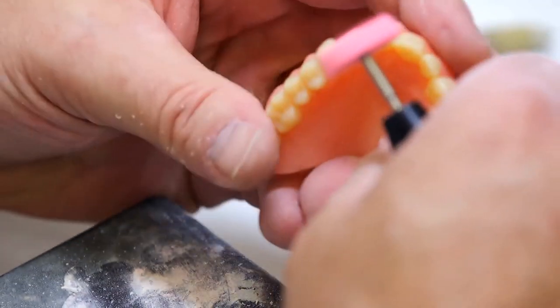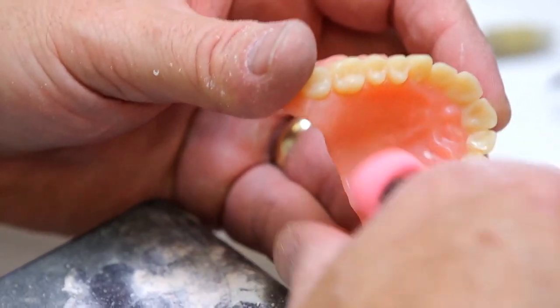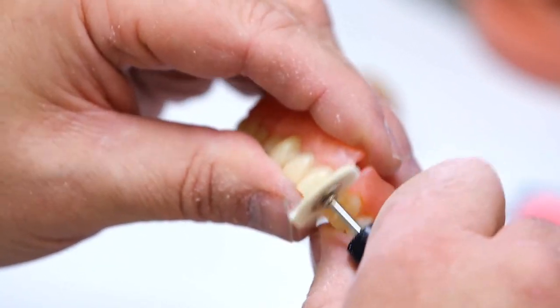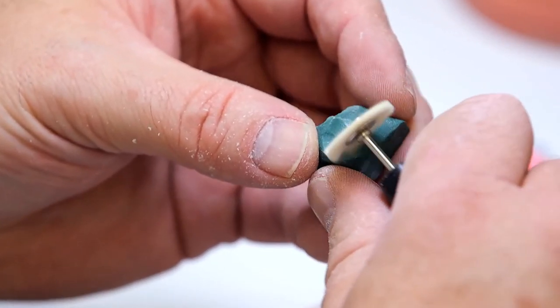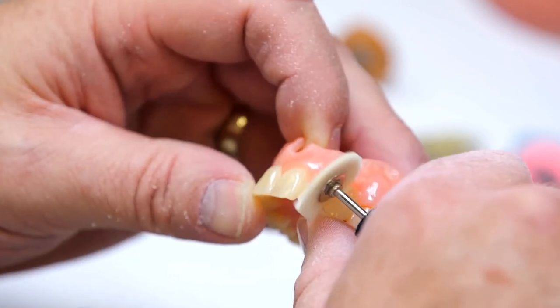Now this wheel is not going to get into the interproximal or completely into the occlusal table. So then we have to switch to another tool. So we'll get the palate polished a little bit here. Again, low speed. I'm always moving, not staying in one place. Now we'll switch to either a medium Robinson bristle brush or a soft. I prefer the soft. And I'll come right in, and this gets nicely into the interproximals. If you need a polishing compound, whatever your favorite bobbing compound is, I like the green. The other bobbing compounds are yellow, that would be that color. And just come right in and do the final polish in the interproximal area.